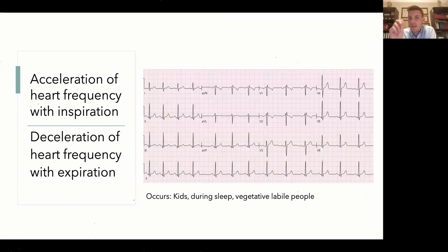So we said that it is a sinus arrhythmia. What does that mean? Sinus will mean that there is a P wave that is positive and present before every QRS, okay? Why? Because there are tiny differences in this and this distance right here that occur with inspiration and expiration. So if you inhale, there will be a bigger heart frequency than when you exhale, okay?